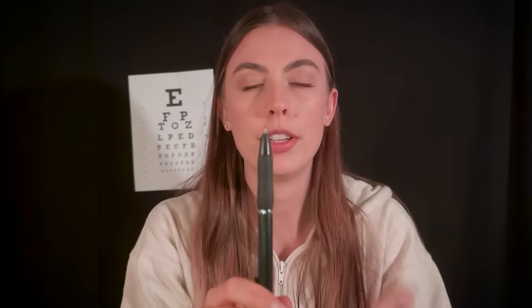No bright lights. No bright lights, but I want you to tell me what finger I'm holding up looking at my nose. Good, that was one. How about now? Good. And good. And very good, perfect. And I want you to follow the very tip of this pen, okay? Follow it with your eyes. Keep following. And then lastly, just let me know when it comes into your vision, okay? Very tip, okay? Okay, good. All right, perfect.